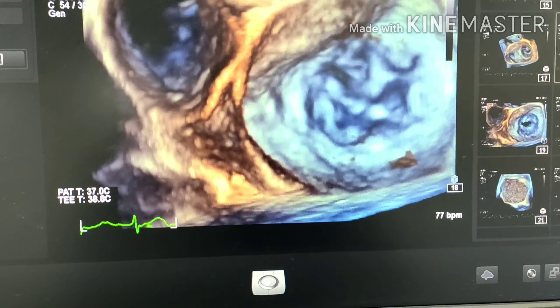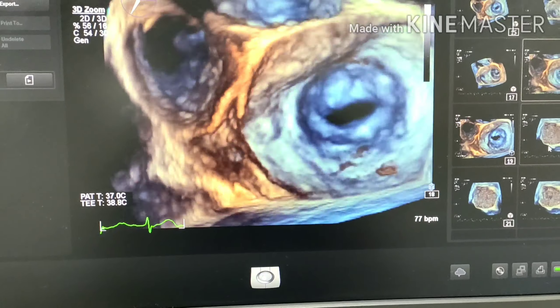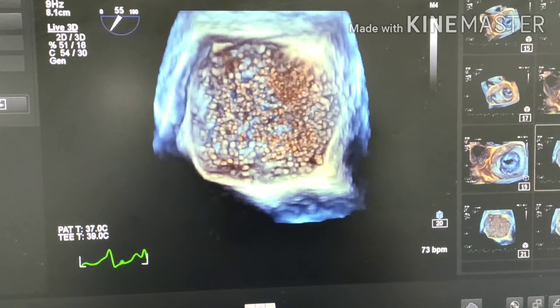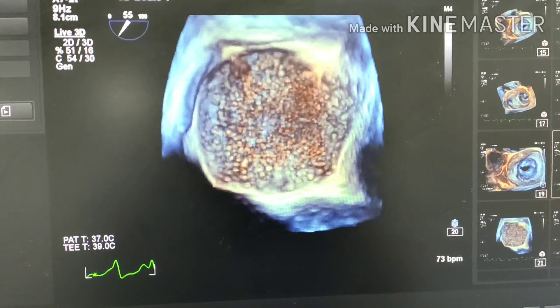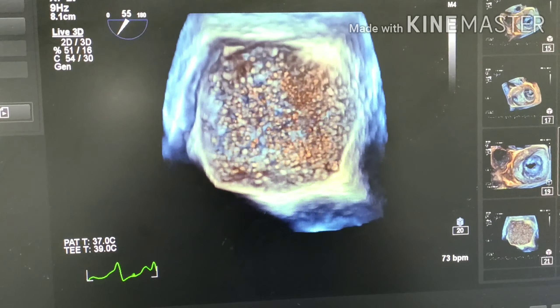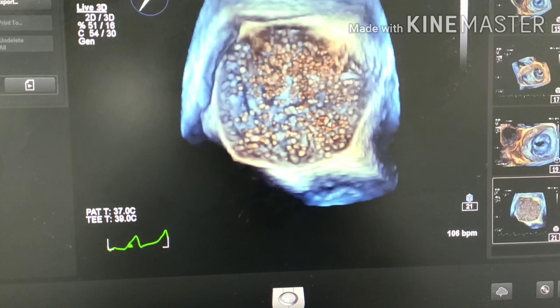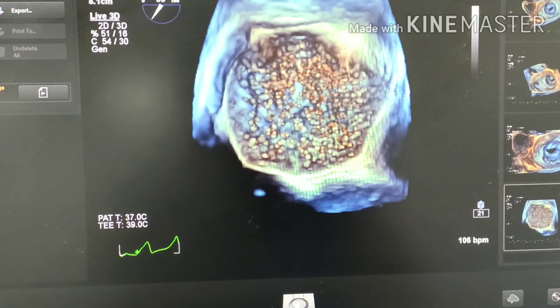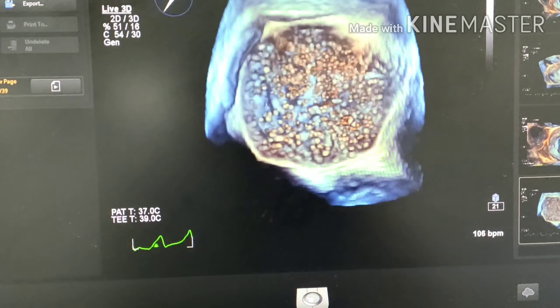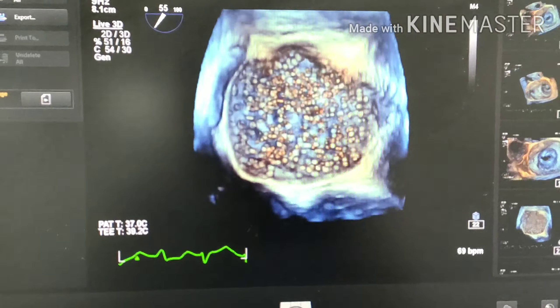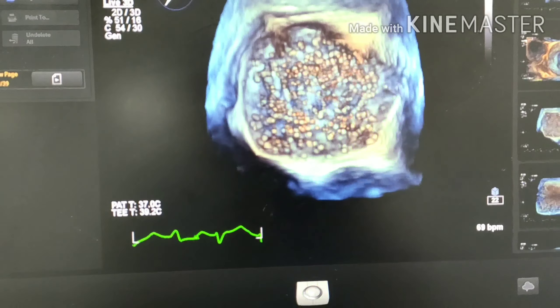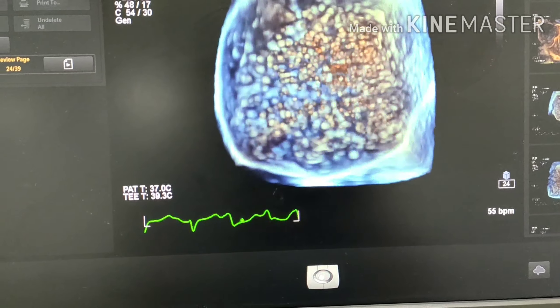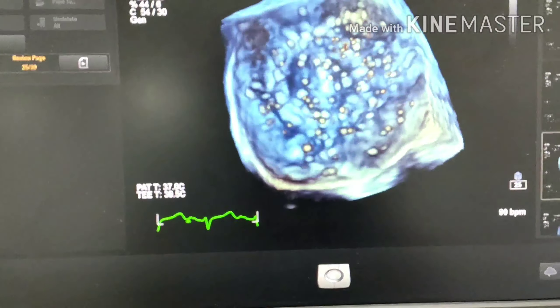We are now proceeding towards assessment of the valve after replacement. This is the first view after the patient comes off bypass. Can you make out what this is? This mosaic pattern and the grainy texture on the en-face view — this is actually air inside the left atrium. You cannot see the mechanical valve as of now because the air bubbles hide the valve beneath. Slowly, as the surgeon removes the air by shaking the heart and counter-ventilation, the air gradually clears.